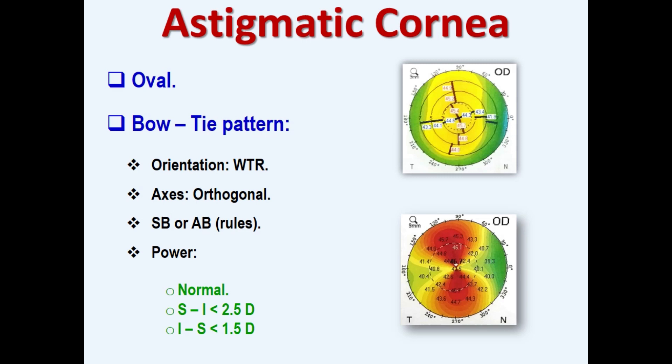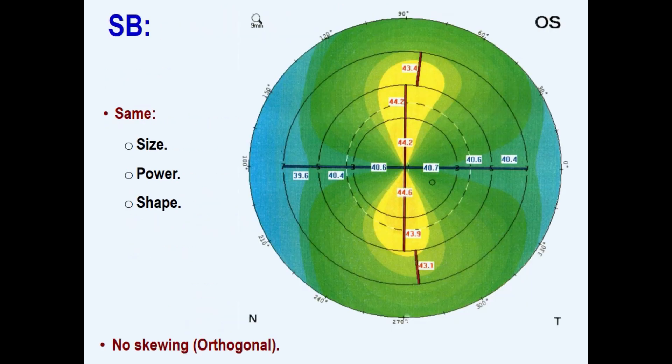Astigmatic cornea can be presented as oval pattern or bowtie pattern. Oval means minimal astigmatism. Bowtie pattern has significant astigmatism but within the normal limits. These bowties are either symmetric or slightly asymmetric.